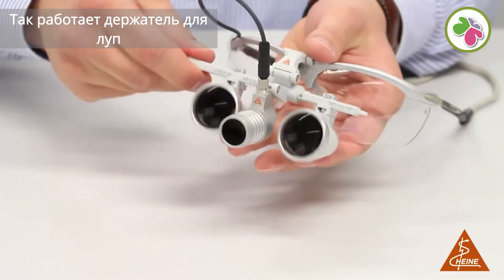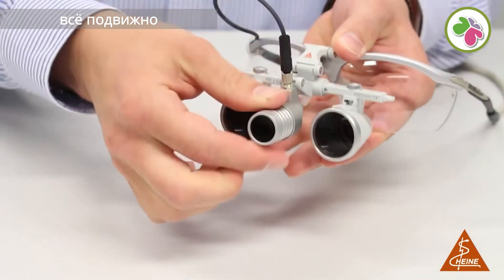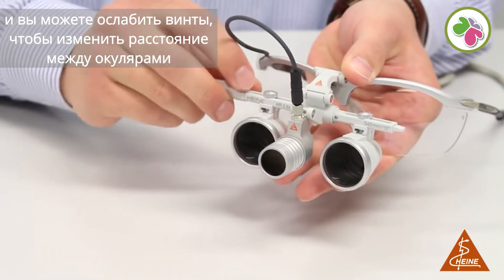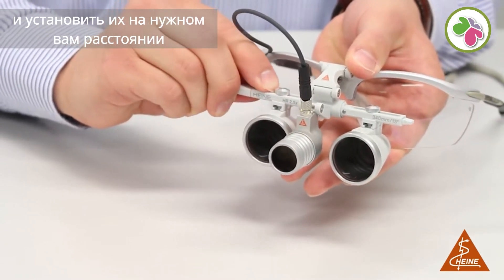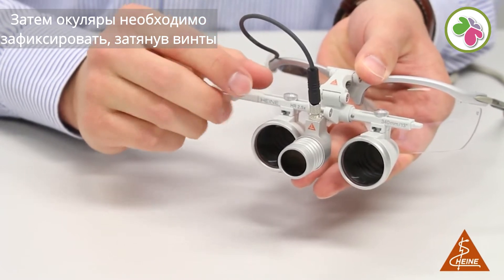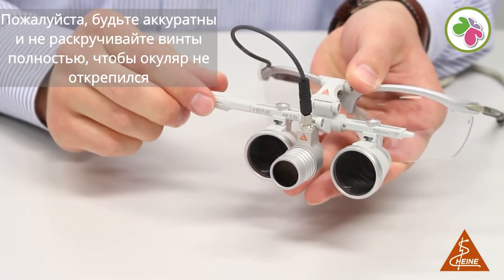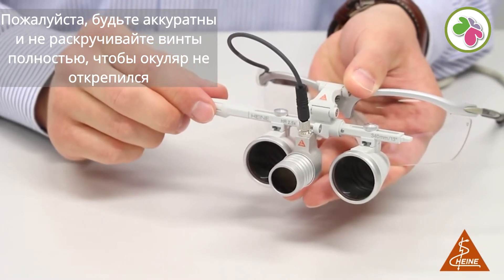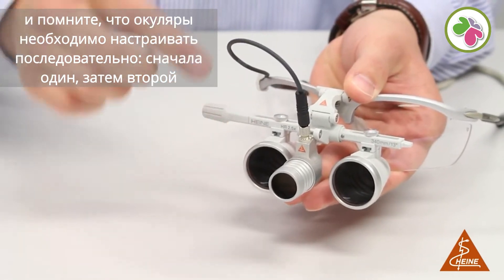This is how the iView loop carrier works. Everything is flexible and you can loosen the screws to change the settings of the oculars and position them correctly. Finally they can be fixated by tightening the screws again. Please be careful not to loosen the screws entirely as the oculars would come off, and remember to set one ocular after the other.